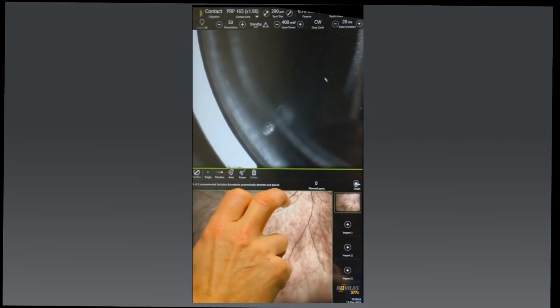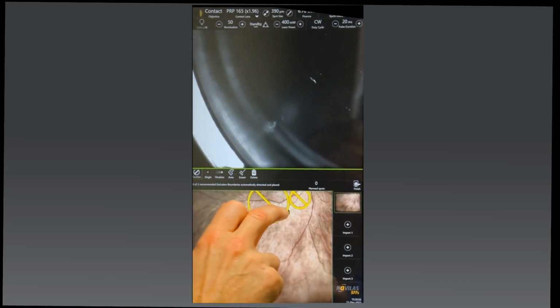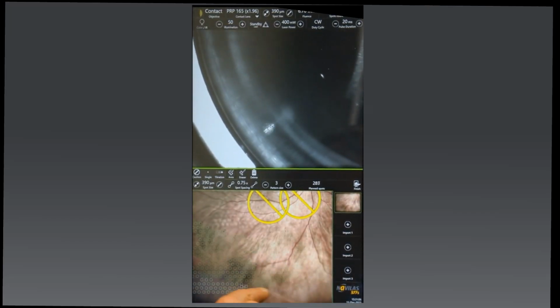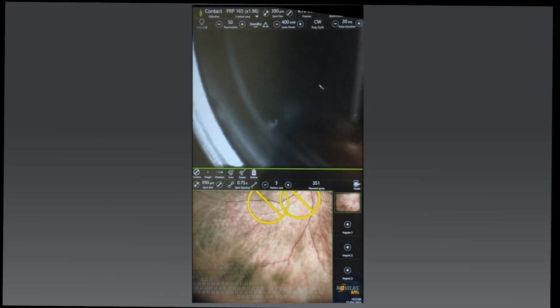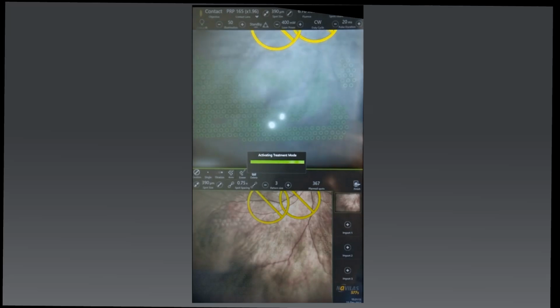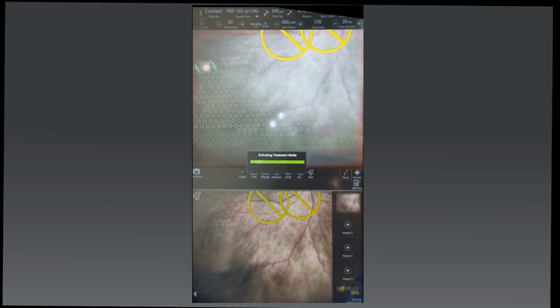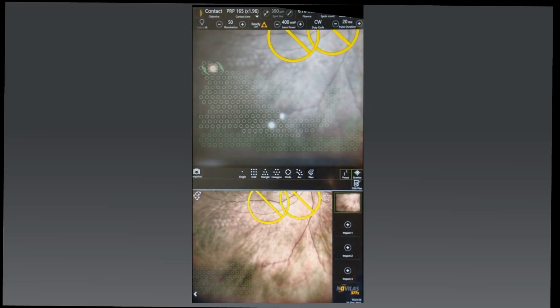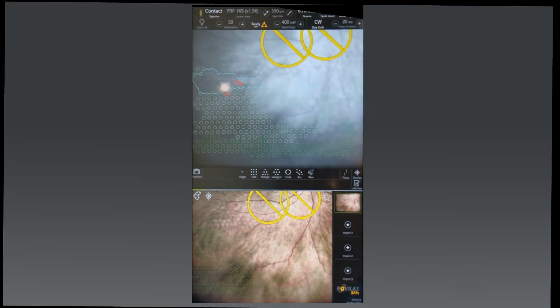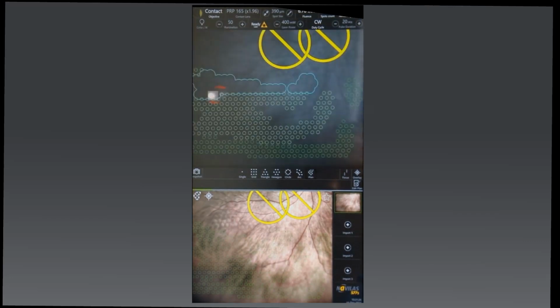Here I'm mapping out quite a large area now. I know he's tolerating it quite well, so I'm emboldened to try and map a large area and see how well he copes with that. And as you see, I'm applying quite a large area of treatment fairly quickly. What's quite noticeable is I'm really not having to pause. The only time I really needed to pause was as I mapped and treated another area of retina. So I was able to do fairly continuous treatment.